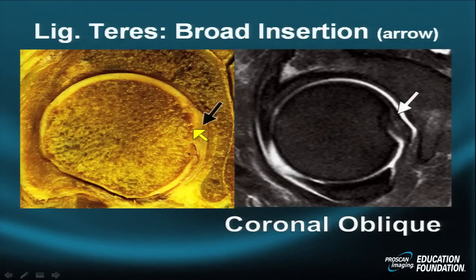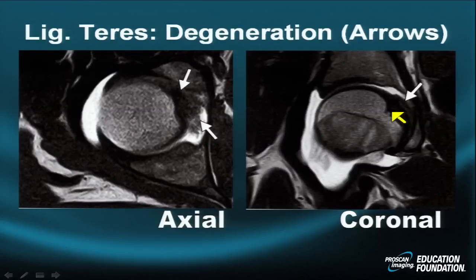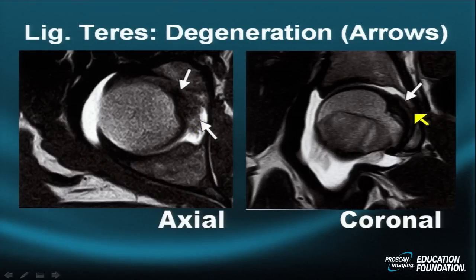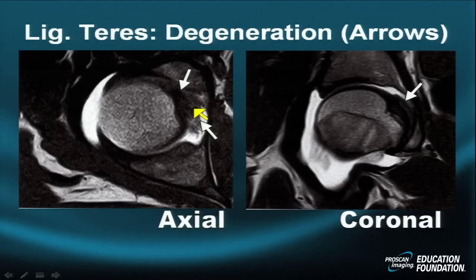An example of ligamentum teres degeneration is seen in the axial projection. It is present in the coronal projection but volume averaging effects reduce conspicuity there. On the left side, bright signal, wispy irregularity, and a frayed appearance of the ligamentum teres are visible as it approaches the fovea capitis.